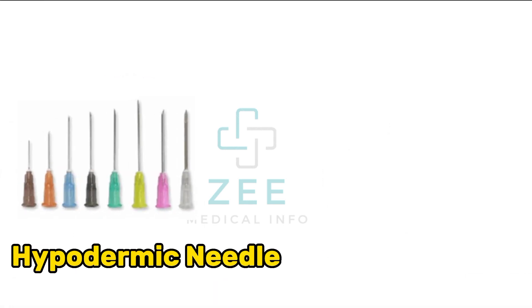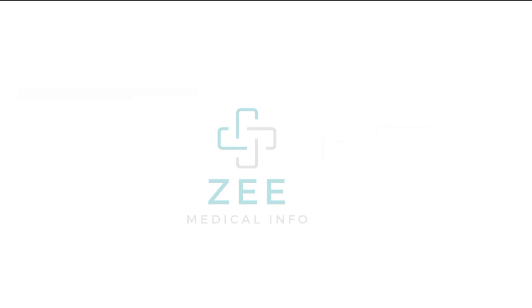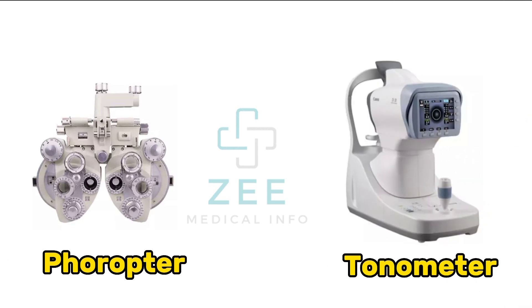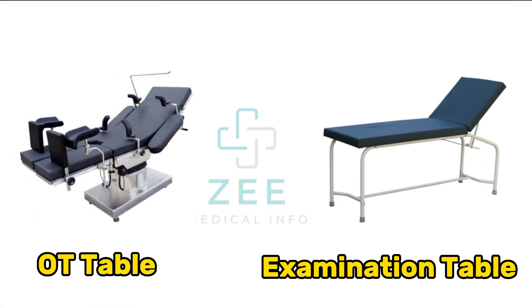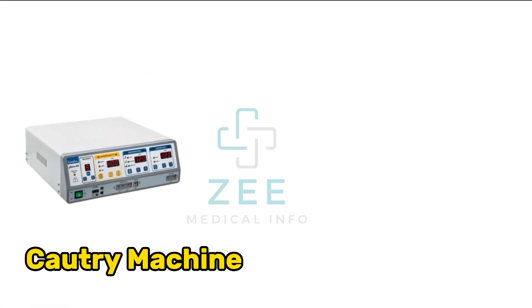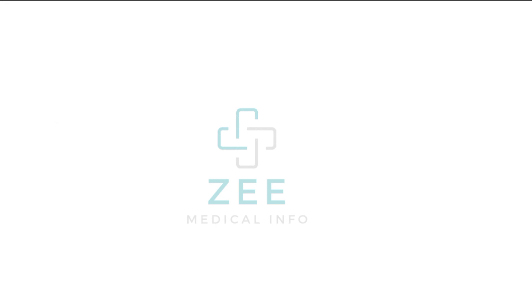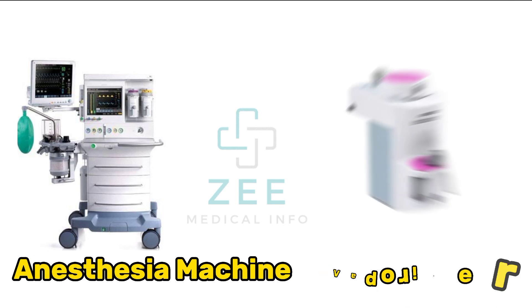Hypodermic needle, disposable syringe, phoropter, tonometer, OT table, examination table, cautery machine, cautery lead, anesthesia machine, vaporizer.